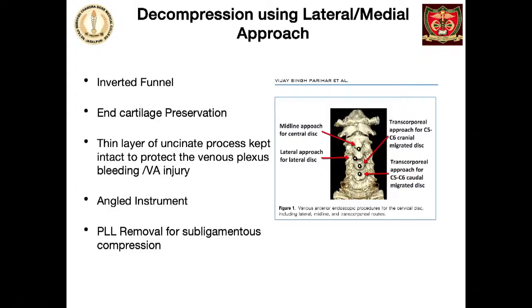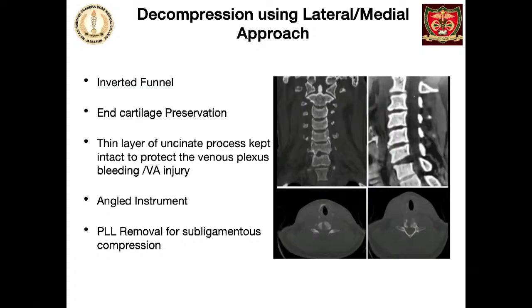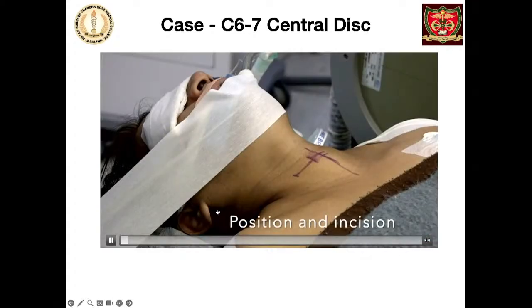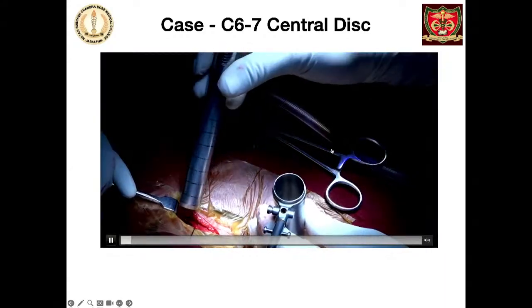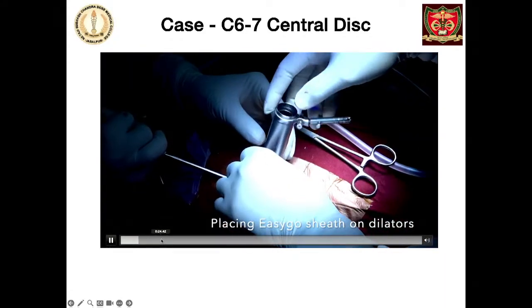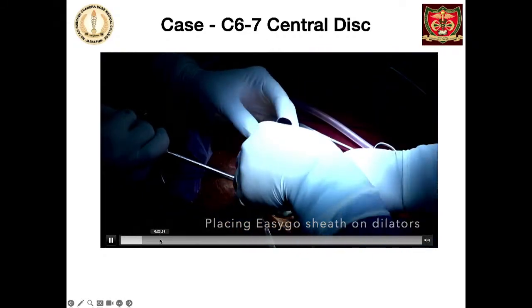So surgery of disc preserving was done with the same principle as ACDF. You have to make a space between the esophagus, trachea and the large vessels on the lateral side, and then you dock your endoscope, and then you create an inverted funnel. After drilling the smaller part at the front, initial part of the body, the larger drilling is done at the posterior end to decompress the thecal sac.